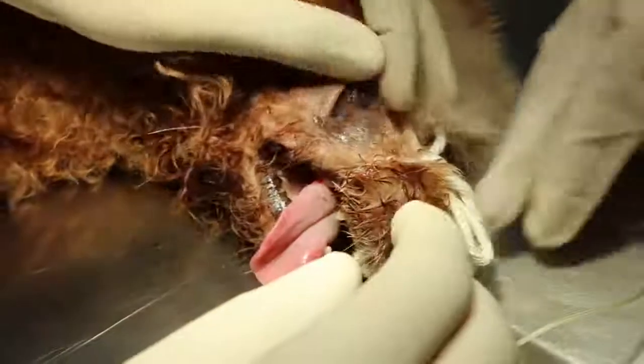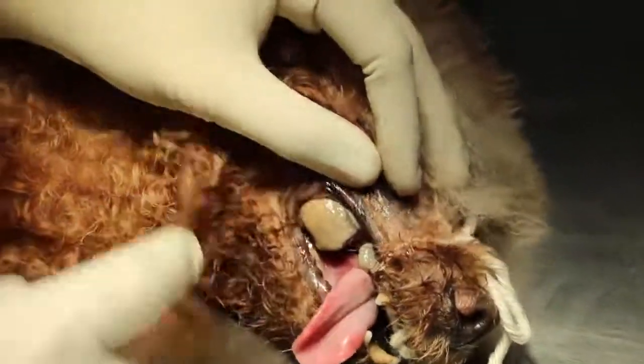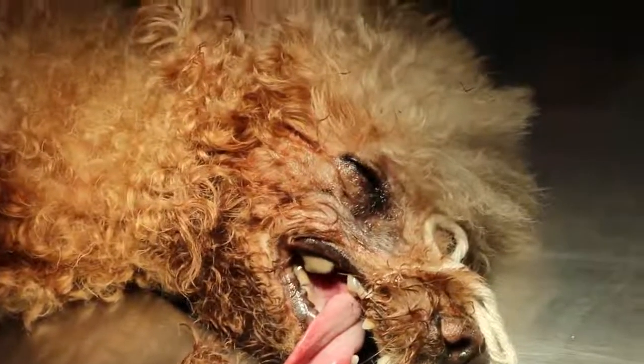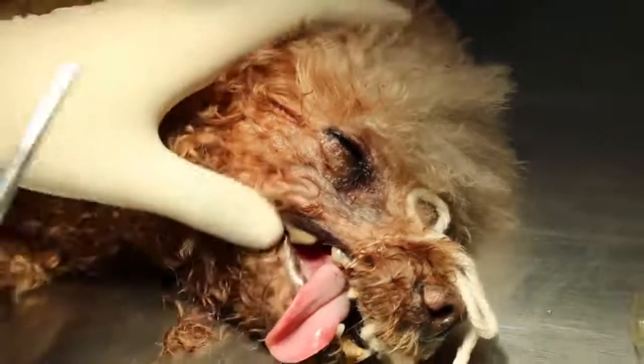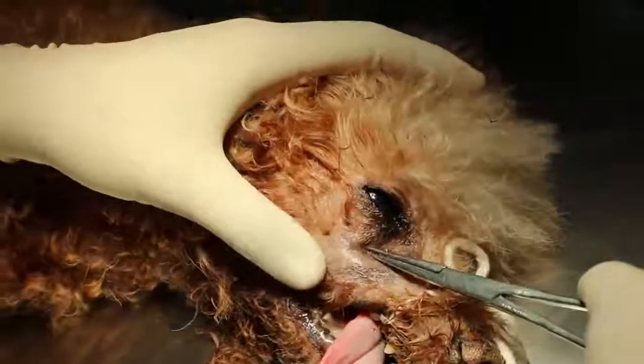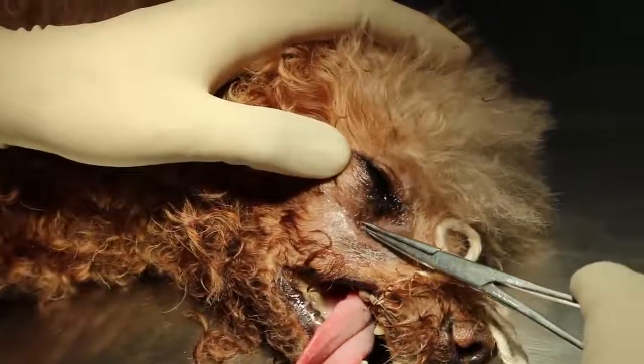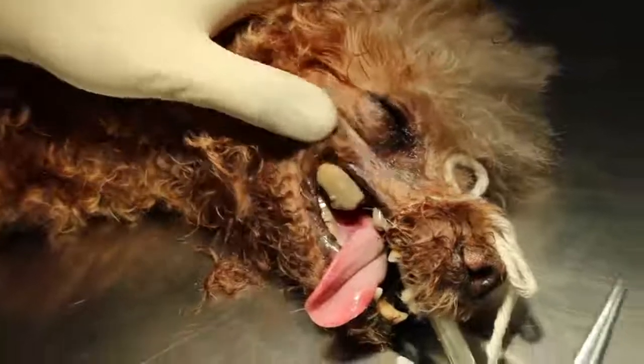The premolar 4 is there. Then use a forcep — you can see that there's a hole going into the root of the wound up there. You can see this is the oral-nasal fistula. You see, it's an open wound. Let's do the dental now.